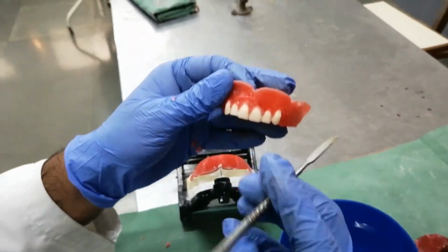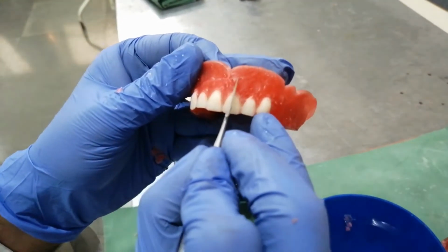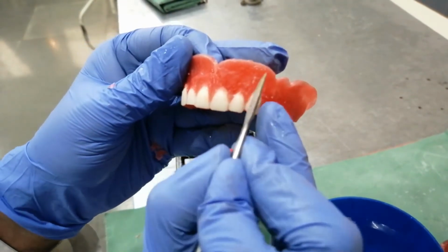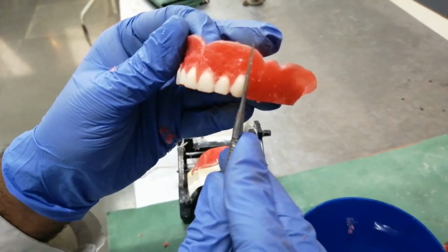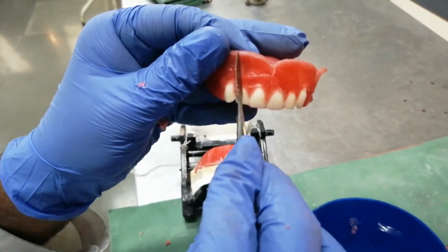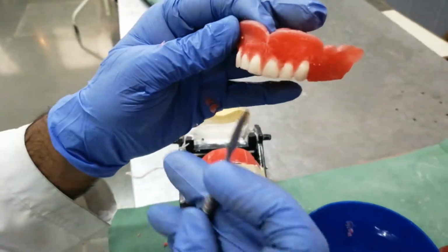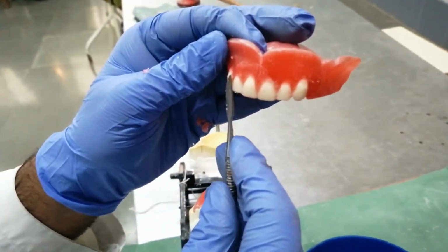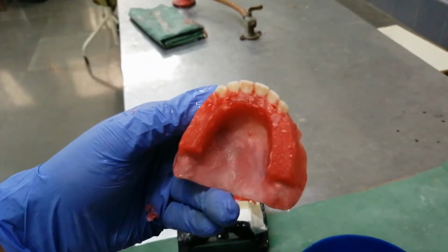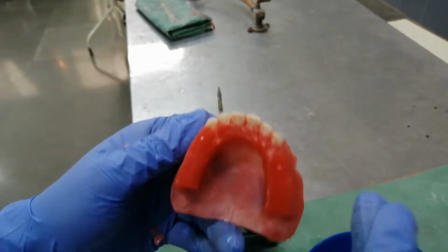Now we will again check the inclinations. The midline, long axis slope towards the mesial. Long axis is parallel to the central's long axis. Long axis slope towards the mesial, parallel long axis. Only mesial slope of the canine is visible. Palatally, wax should be removed up to the cingulum.